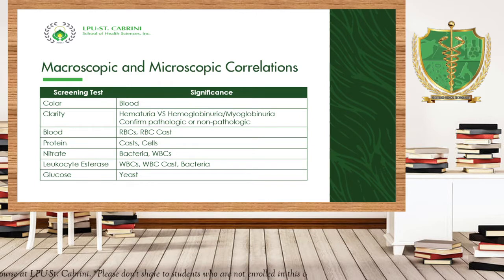And lastly, we have glucose. In positive glucose, there will be a possibility that there will be a presence of yeast. Bakit po may yeast? Lalong-lalo na sa mga diabetic patient. Bakit po mataas yung yeast? That's why there was a study conducted by my classmates. I don't know why they conducted this study, but well, it's a study. Then we have to mention it since it is relatable or significant in this discussion.